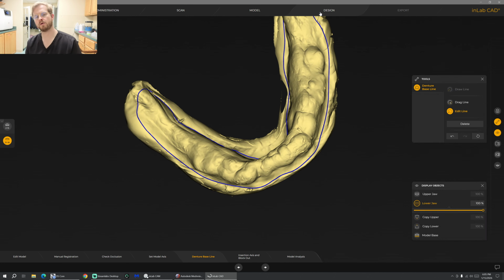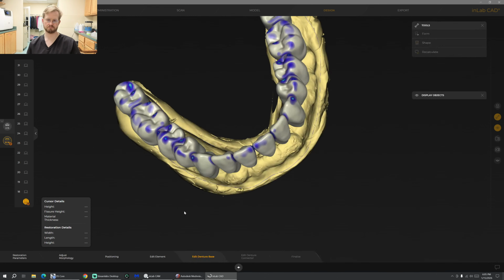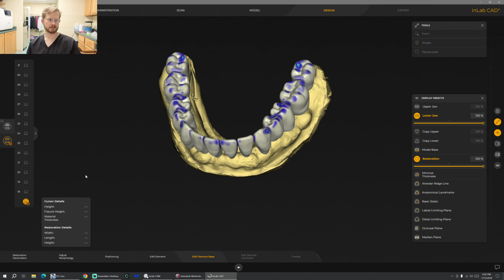One more time. Give it one more try. Let's see. Hmm. Let's try this.